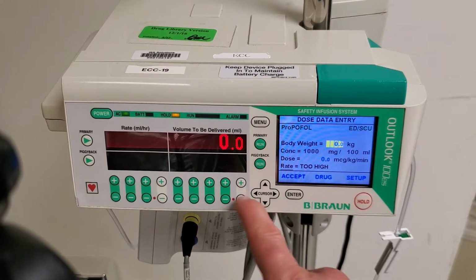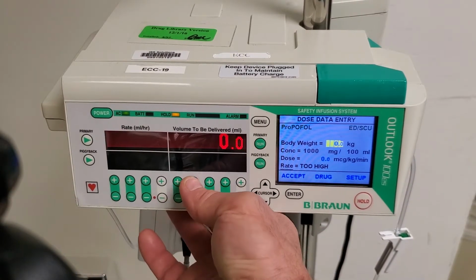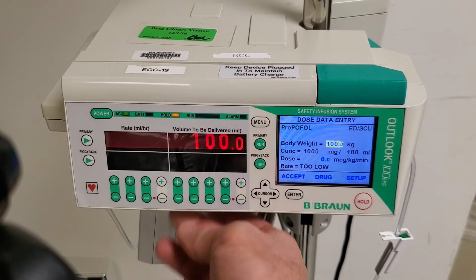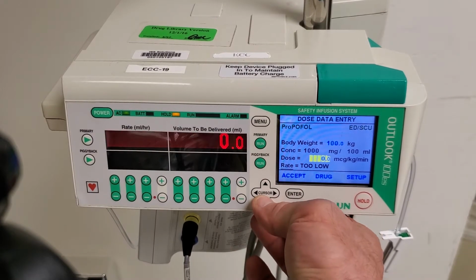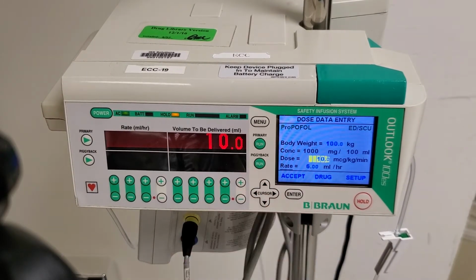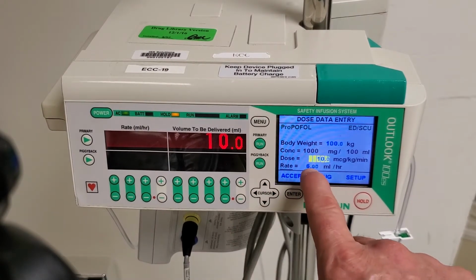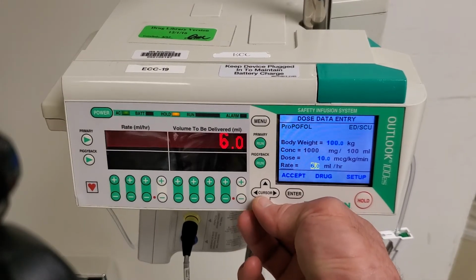First thing it needs us to do is enter the body weight. Notice that the numbers are lit up over here. So we use these buttons beneath the decimal places to enter our patient weight, 100 kilograms. Move the cursor down, select our dose, start at 10 mics per kilogram per minute. It calculates that that will deliver a rate of 6 mLs an hour.